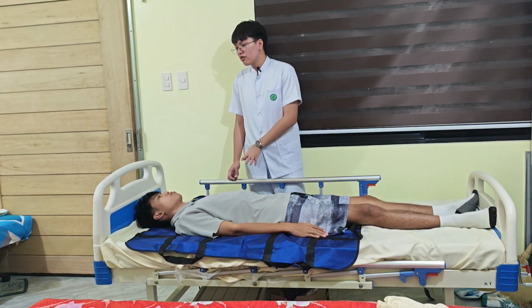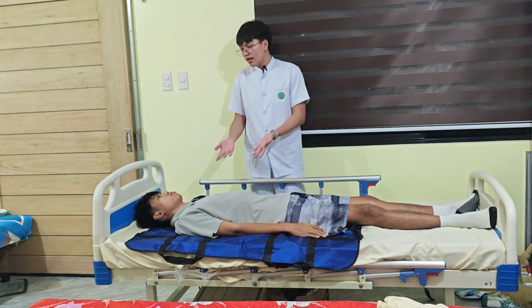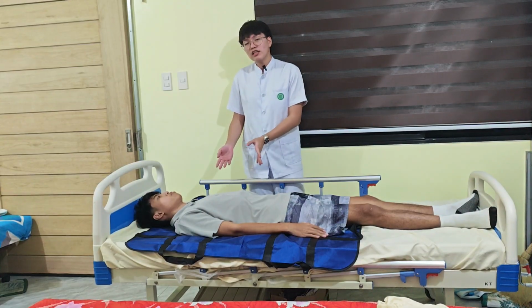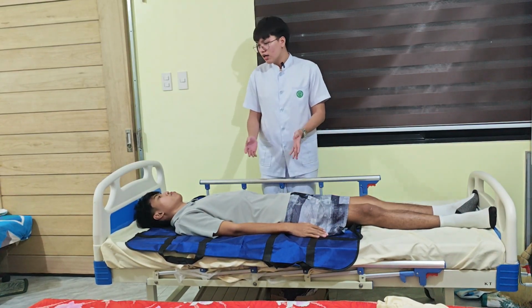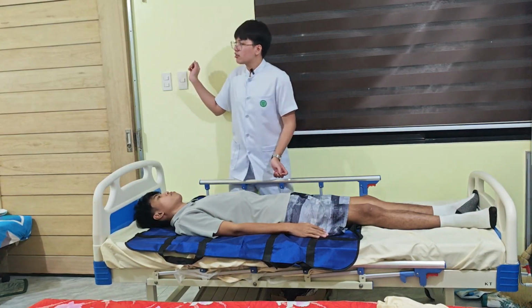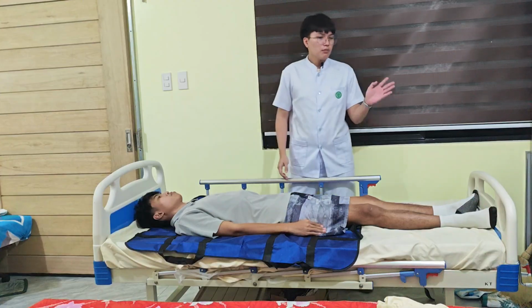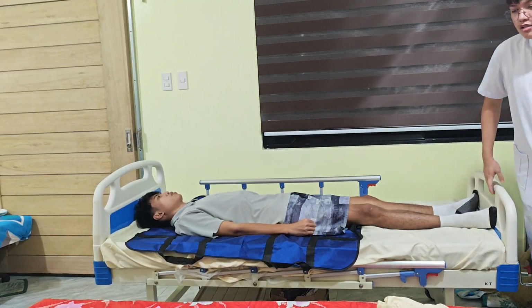Next, we're going to perform hand hygiene. After performing hand hygiene, we're going to identify the patient and explain the procedure to the patient. Assuming that we've already done that, next we're going to provide privacy by closing the curtains. After closing the curtains, we're going to put a bath blanket on the patient. Let me just get the bath blanket.